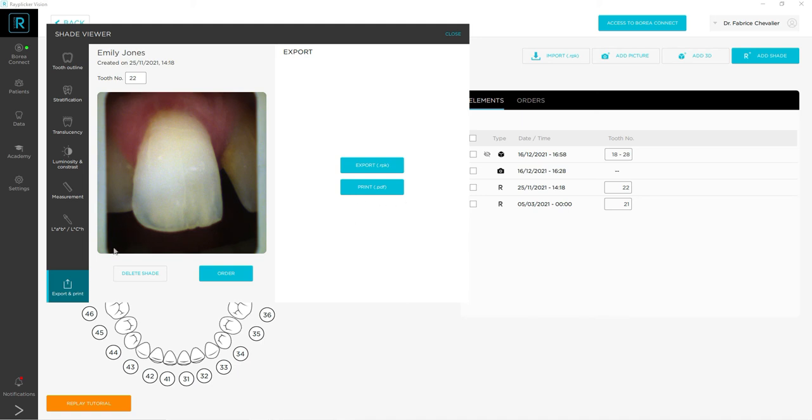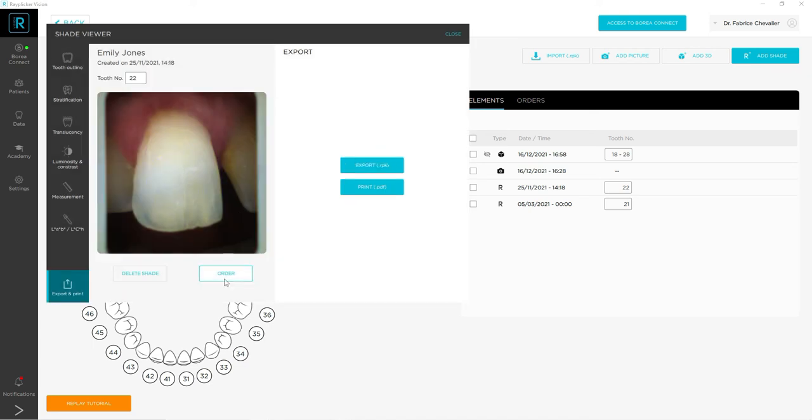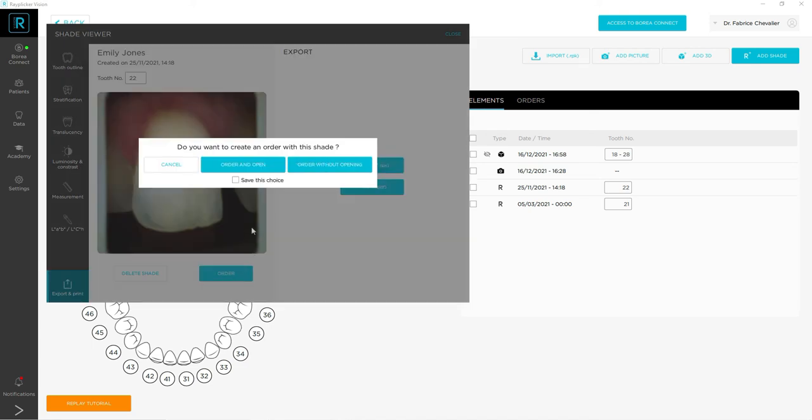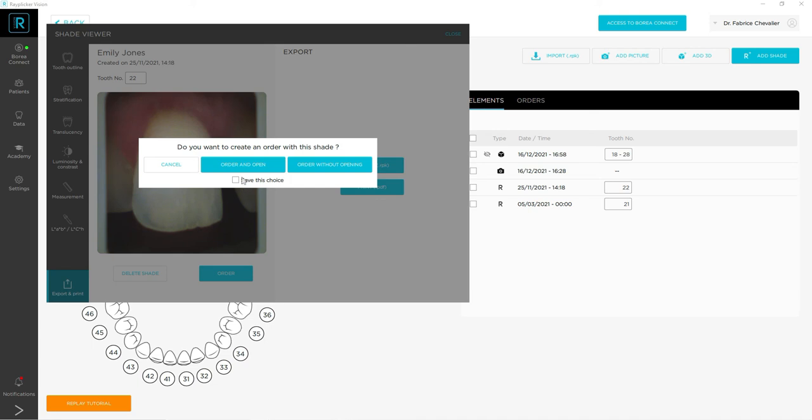You also have two buttons: you can delete the shade or order it. These are shortcuts. If you click on the second option, you have three choices. You can cancel this window, you can order and open, or you can order without opening. The order will be placed then on the Borea Connect platform that will be explained in another video. And if you check save the choice, this manipulation will be done automatically and you will not be asked anymore.